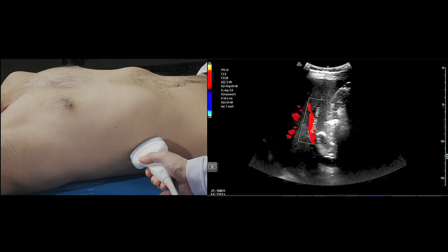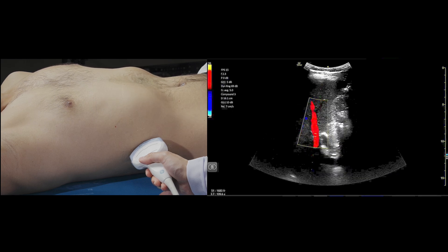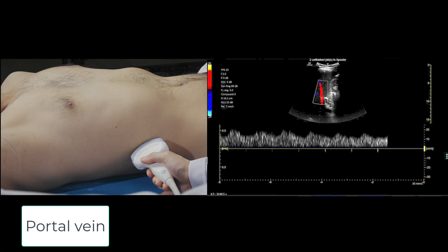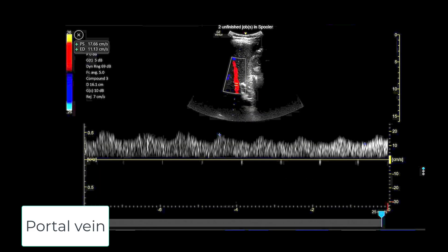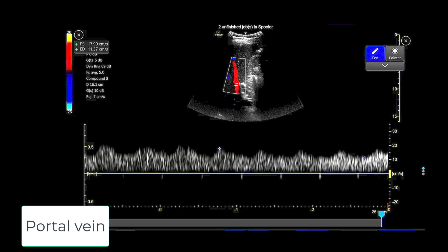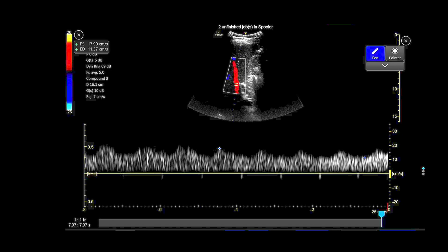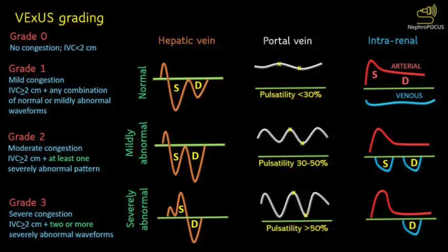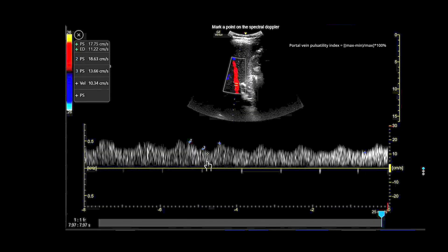We put the sample volume at the portal vein, aiming to place it at the main portal vein and not the branches. Normally, the portal vein waveform has a continuous pattern with limited pulsatility due to hepatic sinusoids that dampen transmission of right atrial pressure. We can measure the portal vein pulsatility fraction (PVPF) by subtracting Vmin from Vmax, dividing by Vmax, then multiplying by 100%. A PVPF less than 30% is normal. Between 30–50% indicates moderate congestion. Greater than 50% indicates severe congestion. Reversed flow below the baseline may indicate very severe congestion.